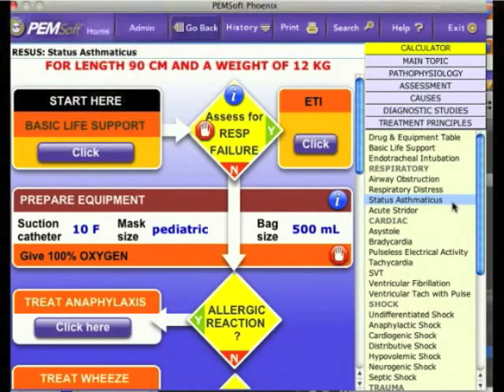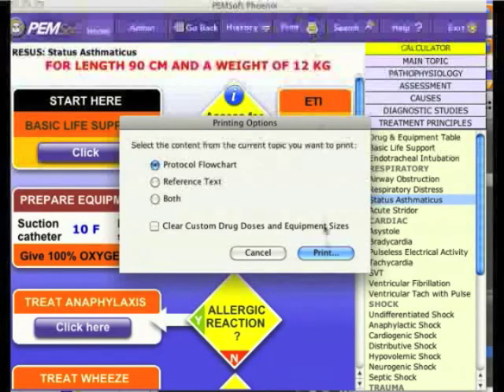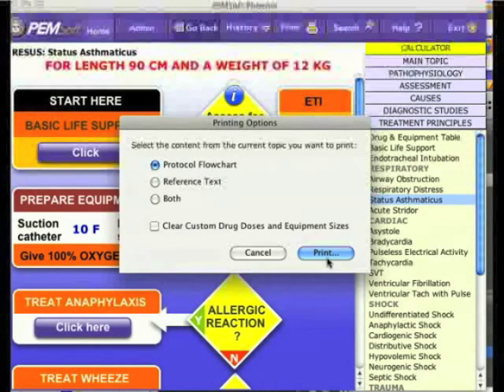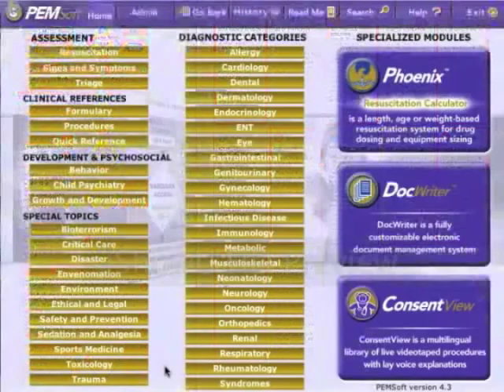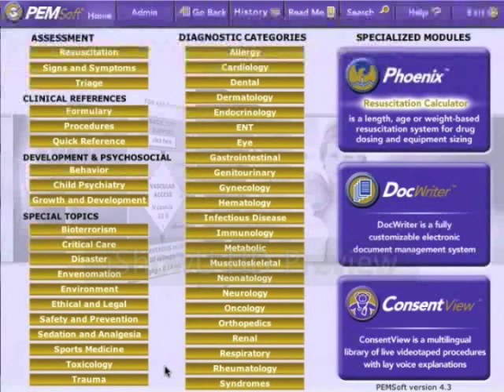The flow diagrams in Phoenix are all printable. For instance, in Status Asthmaticus, select the Print button at the top menu bar. A pop-up window will ask you whether you wish to print the color flow diagram alone, the clinical reference text alone, or both. We have now reviewed the capabilities and navigation features of the Phoenix Resuscitation Calculator. This concludes training session number two.